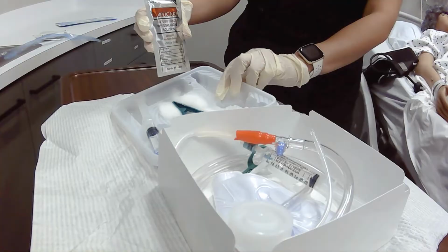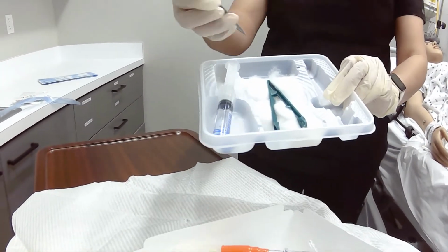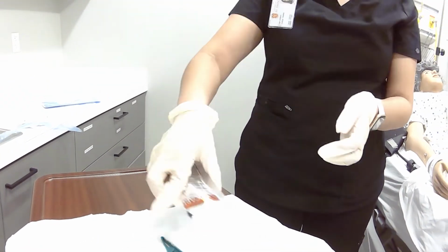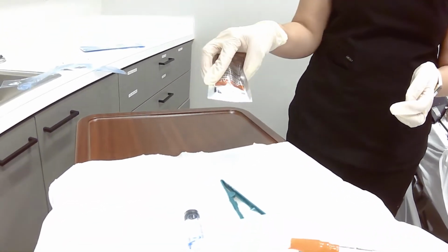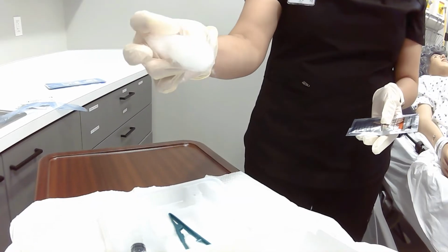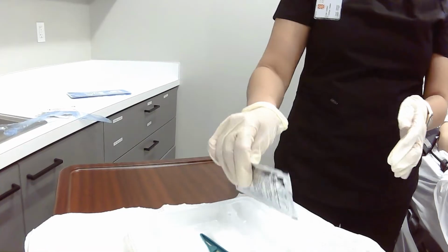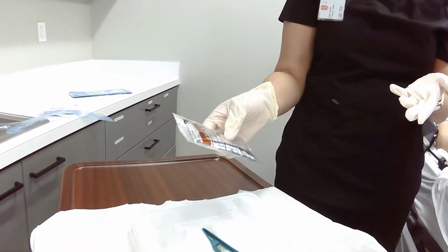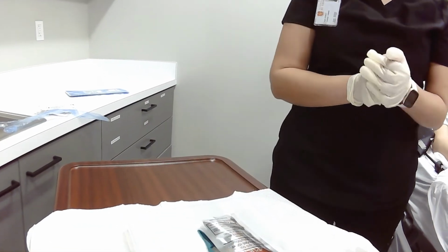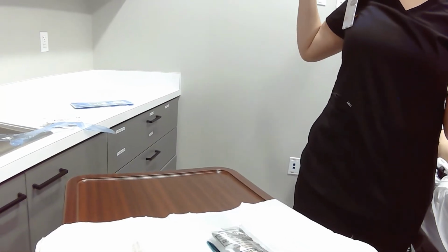So this particular kit is going to have cotton swabs and the iodine pack. With this piece, you would open the package and then spread it over the cotton balls. Just be wary that with the cotton balls, you can get some of the lint. So you want to make sure that it doesn't go inside the urethra, which could cause infection or potential for infection.